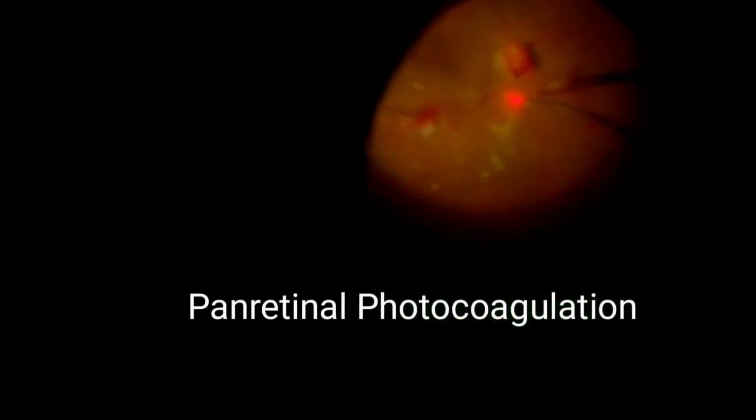The bleeders were cauterized intermittently. Retinal photocoagulation was done, followed by fluid-gas exchange and silicone oil.